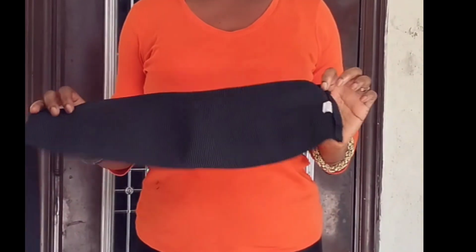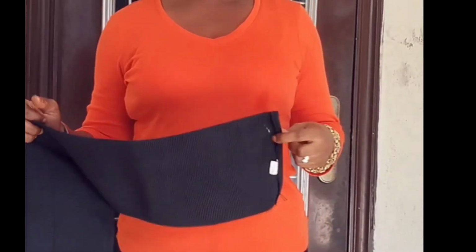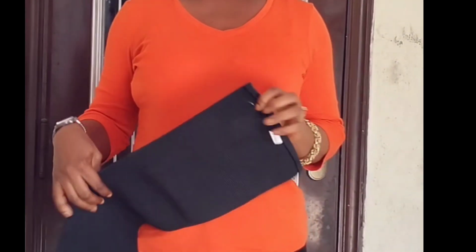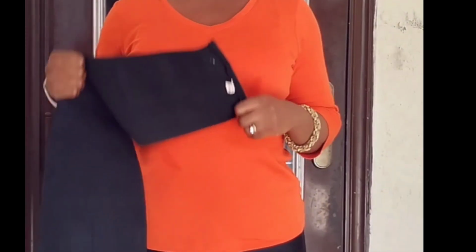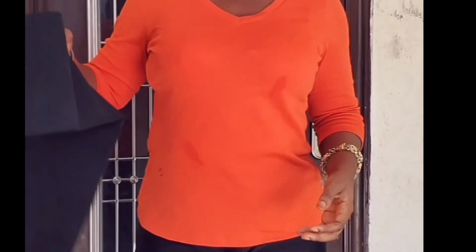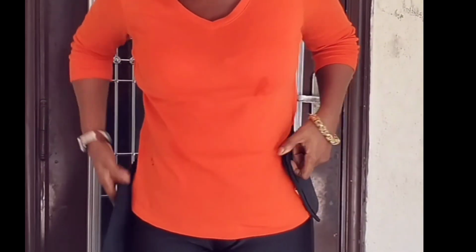So this is the exact type of belly wrap I used 6 days after my CS. I'm 5 months post CS now. So I want to show you how to use it. Now the first thing you should know is never use any belly wrap or any waist trainer that has bones. It must be free of bones. So this type is what I used. In fact, this is the exact one, the exact type I used, the white one. I've given that to someone.